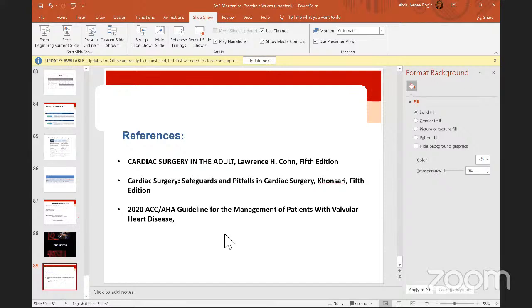Okay. Doctor, how about in patients with aortic regurgitation? Do you usually go directly with retrograde, or do you just open and do a direct ostial cardioplegia? With the retrograde, and open and give direct ostial, to give the best protection possible. Okay.